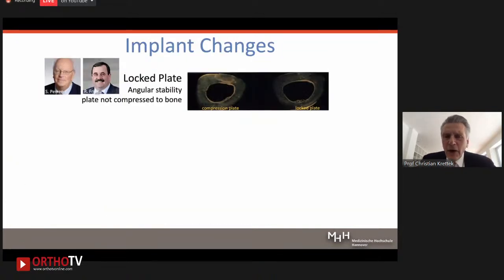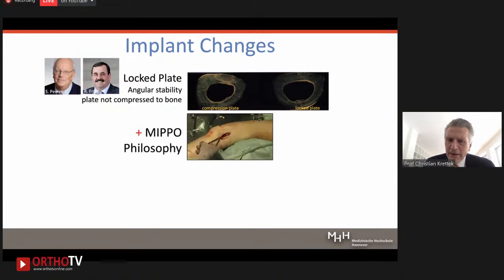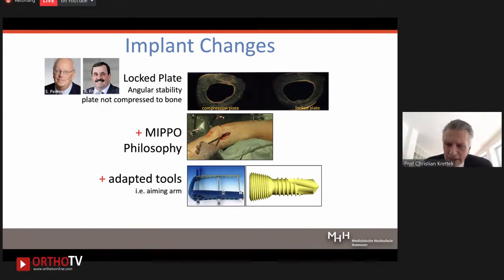these new problems. So implants were designed, and you have seen these were implants from before the era of locking plates. The implants have changed, and in the 90s we met the phase of the locking plate, which goes back to Stefan Perren and Robert Frigg. They developed this locked plate concept, which also respected blood perfusion more. This was then combined with the minimal invasive philosophy, with the MIPO philosophy, and adapted tools, handles, specific screws, ending up in a less invasive stabilization system, which has successfully entered and conquered the orthopedic world.